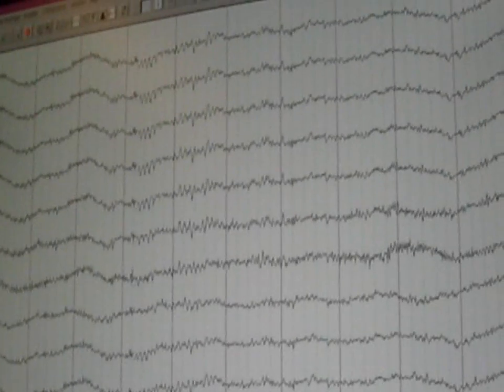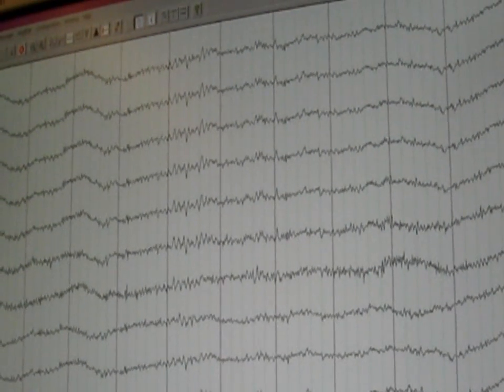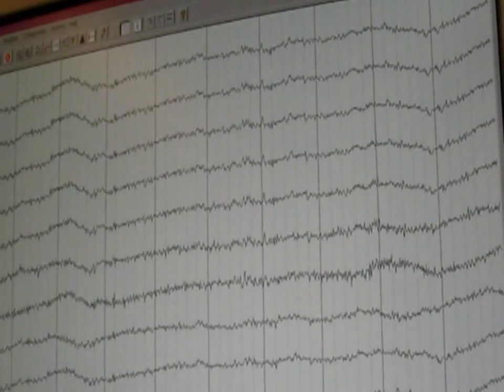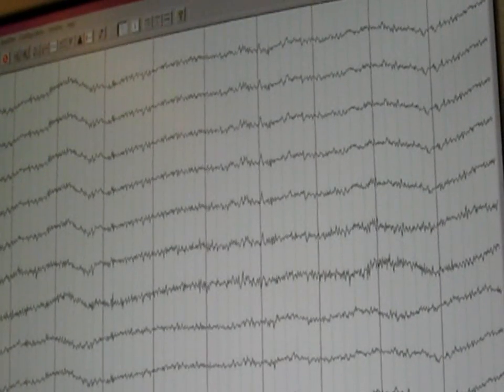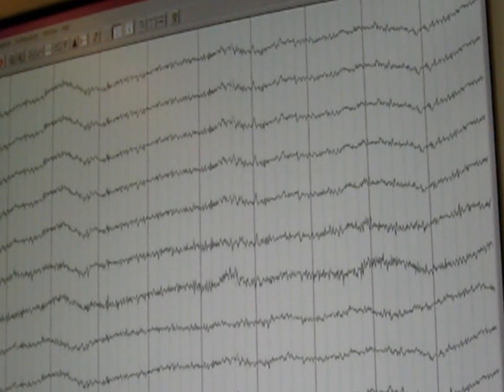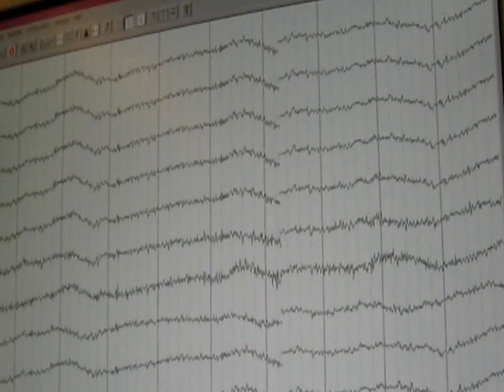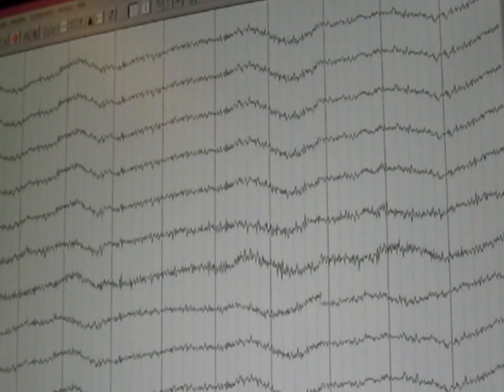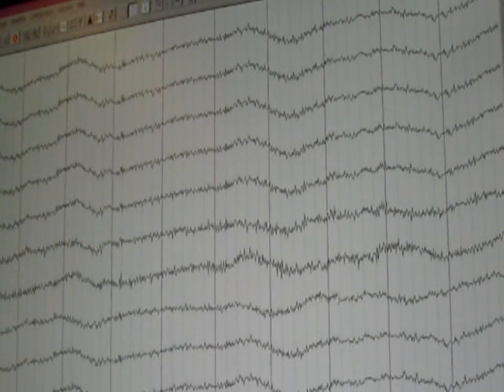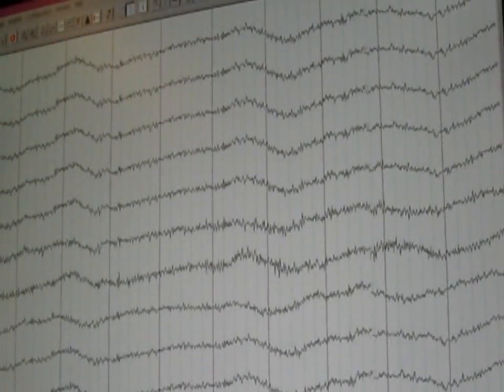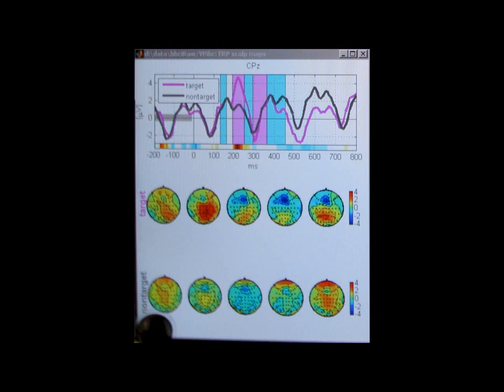So that was some pretty cool stuff, but it gets even better. Each of these lines there represents a single electrode that records a reading of a very specific area of the brain and what you can actually do with this is produce a brain map. So you have an overview of the activity going on over the whole brain.